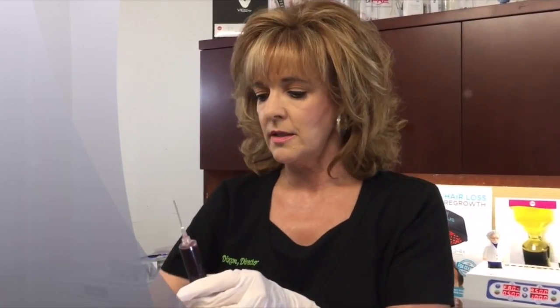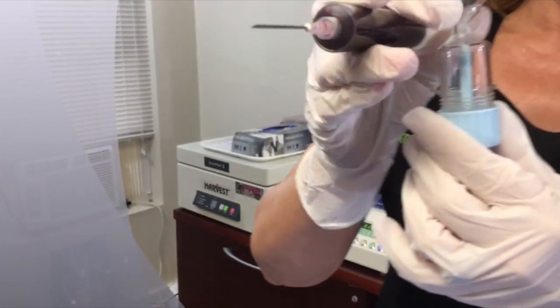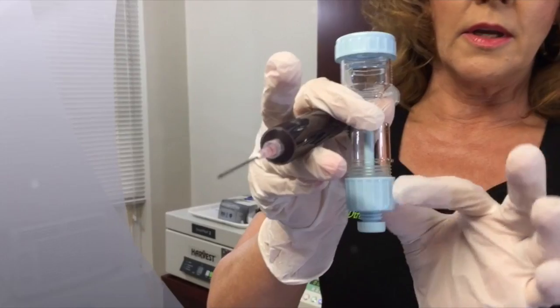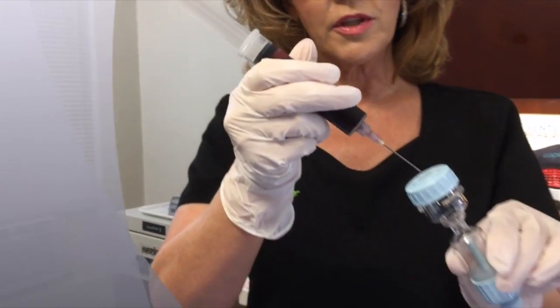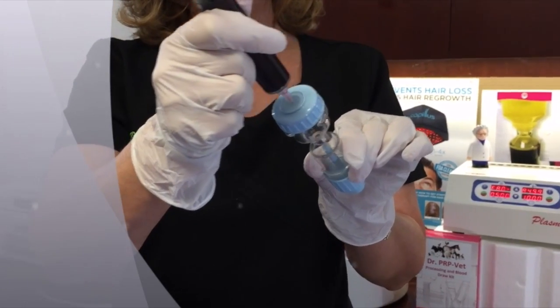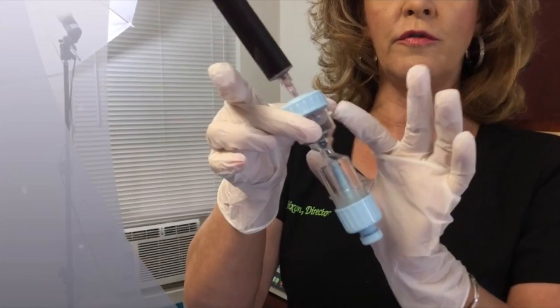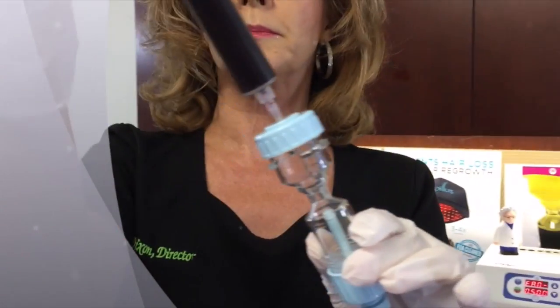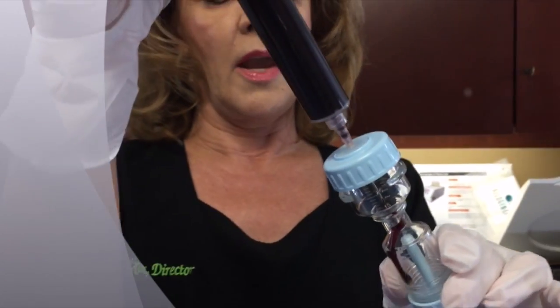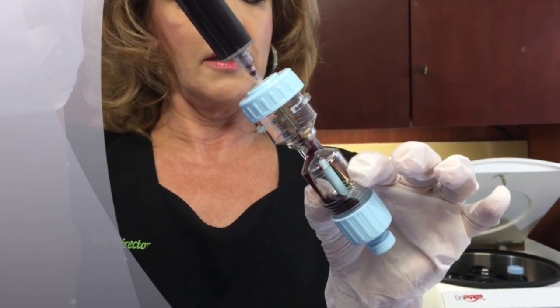Then you're going to inject your blood sample into the Dr. PRP kit. Make sure the end cap is secure. There's a center port — you'll place your needle right into that center port, holding the kit at a 45 degree angle to prevent getting an airlock, and begin to inject your blood sample into the processing device.